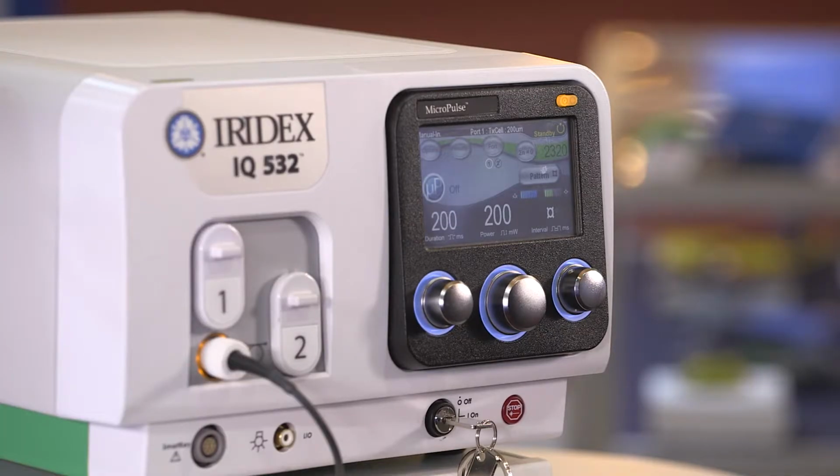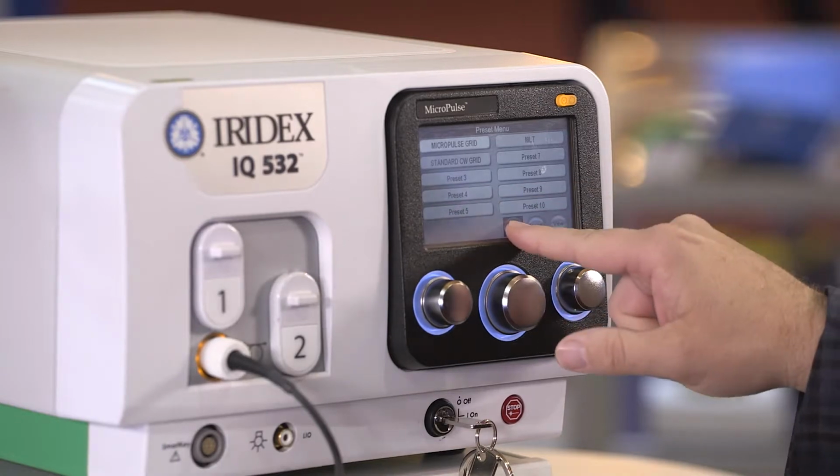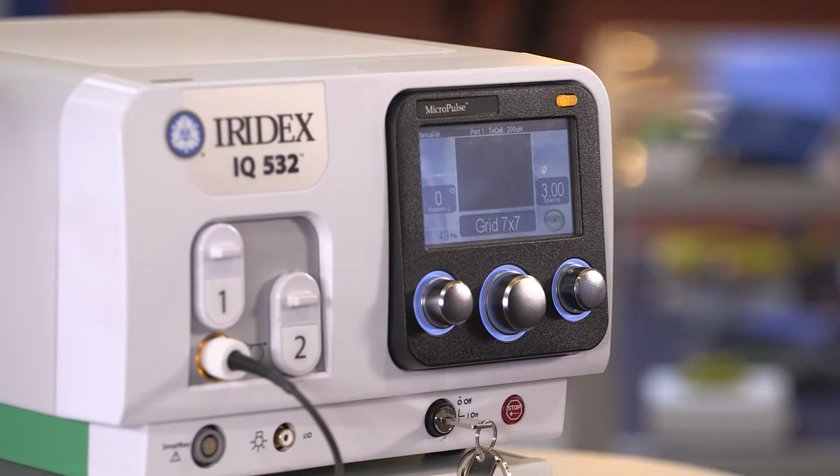Go to our MicroPulse technology in the MicroPulse setting. You'll notice that again we're in a 200 millisecond duration, this time with a 400 milliwatt of power, 5% duty cycle MicroPulse technology. Again, we're going to look at a 7x7 pattern grid.